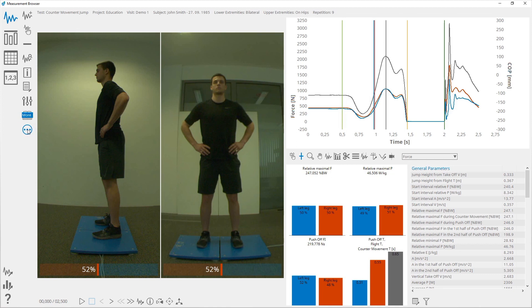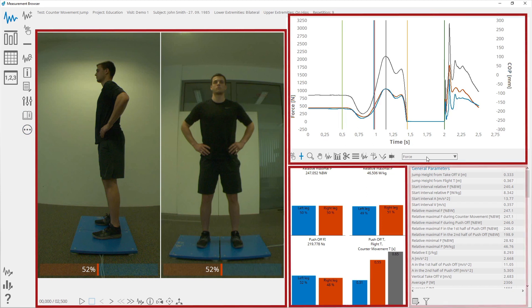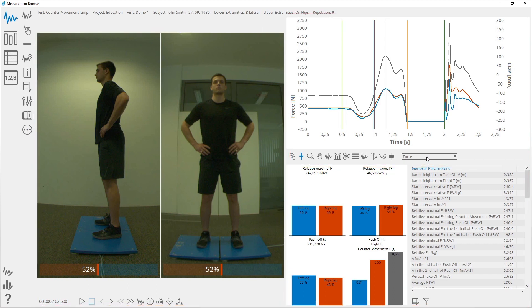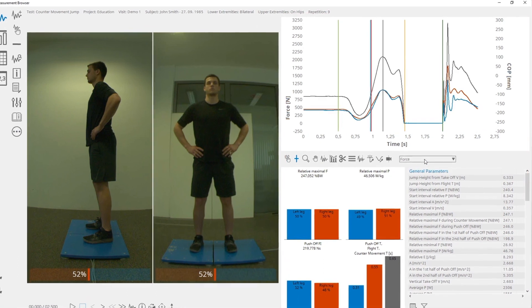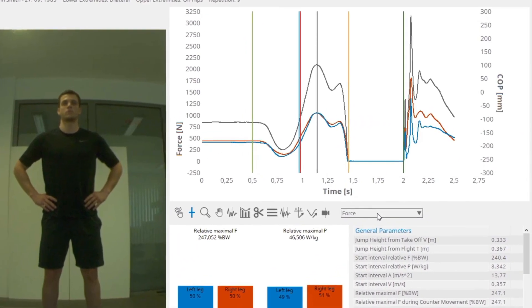In the center of the analysis view there are various types of data visualizations for the selected measurement. The collection of visualization types depends on the device configuration and acquisition settings. The graph represents the signals acquired with the force plates — you can switch between these signals and the COP view.